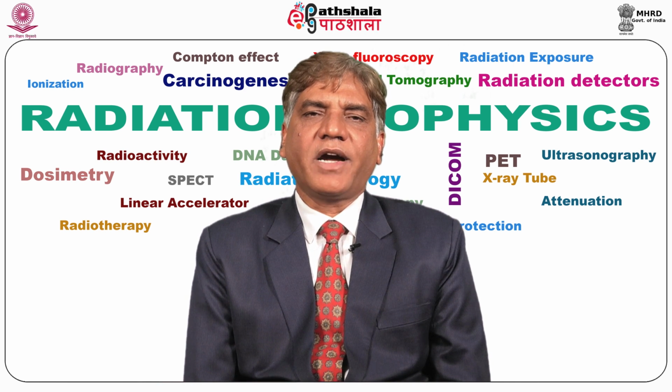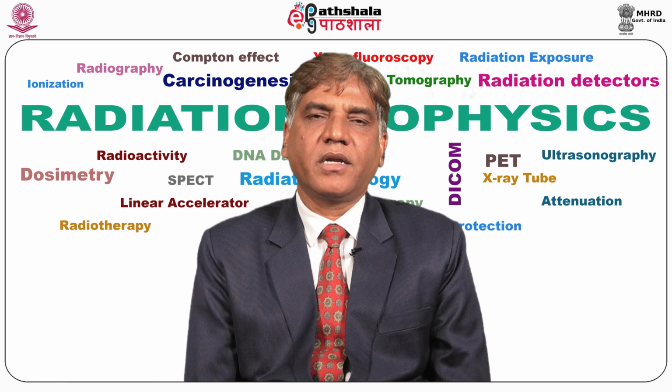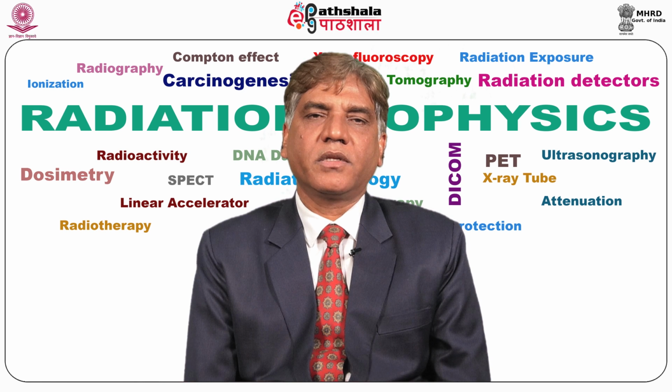Digital radiography is defined as a method of radiography in which the image is constructed from numerical data, and information is represented in the form of discrete units, that is, numbers, and involves the use of a computer. It uses a matrix to represent the image. Matrix is equal to the rows times the columns. The smallest unit of the matrix is called a pixel. A pixel is the stored individual grayscale value of an image.